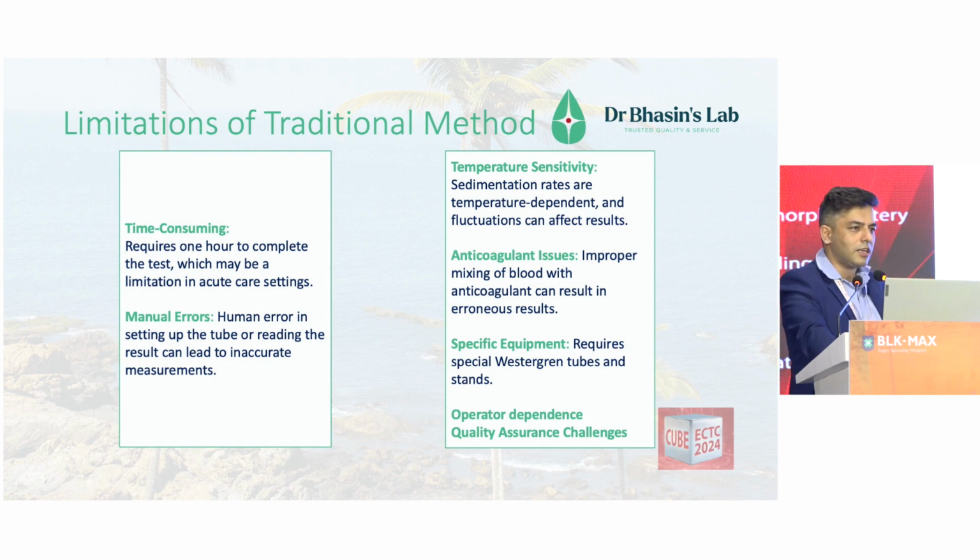And when those results come up, the doctor is asking us why they don't match. So, anticoagulant issues, improper mixing of blood with anticoagulant, but that's sorted now with the tubes, and operator dependence and quality assurance is a big challenge in a traditional ESR.